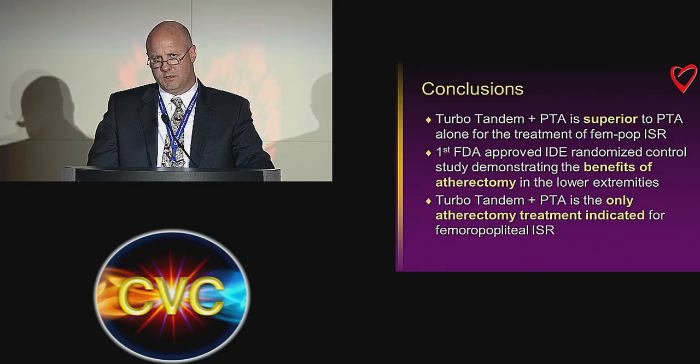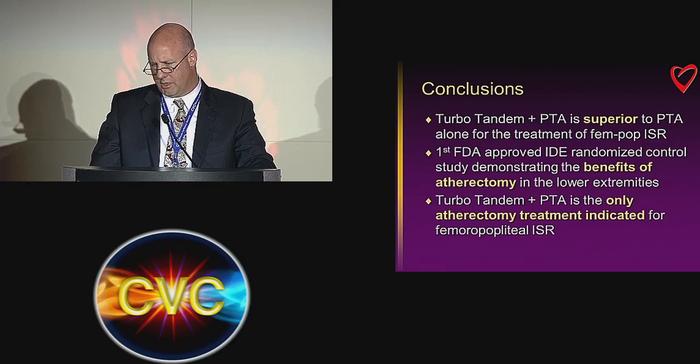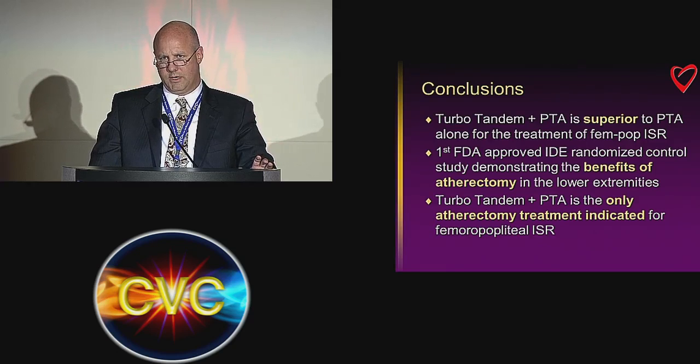And we've also seen some drug-coated balloon data coming out of Europe, the FAIR trial, the Copacabana trial, and so forth. But if you look at some of those studies, there are only 40 to 80 patients. The lesion lengths are 6 to 9 centimeters. Again, relatively short, simple lesions.